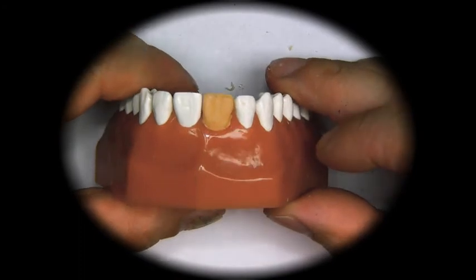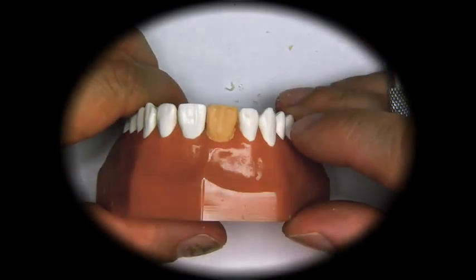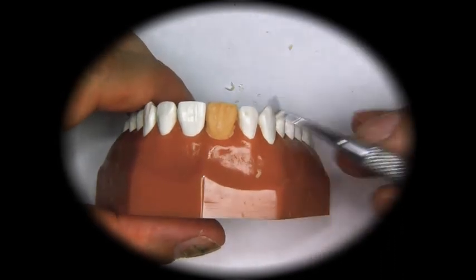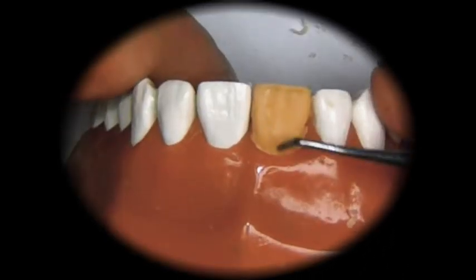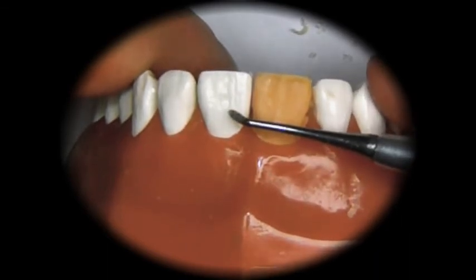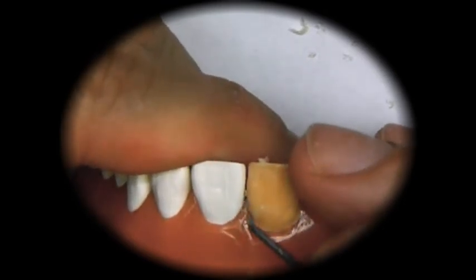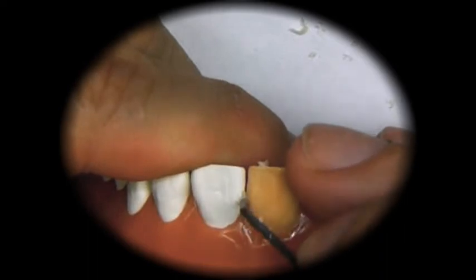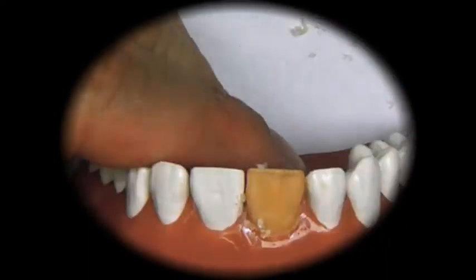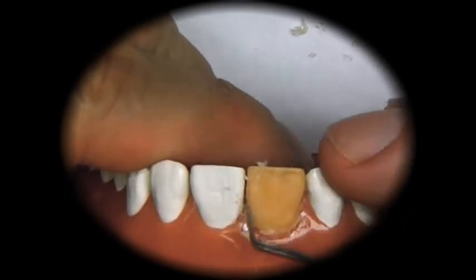So now almost down to the right size. Since we have this tooth running in a divergent direction from this tooth, what we're going to have to do is take away from the mesial portion of the tooth to try to tilt it back towards the mesial.